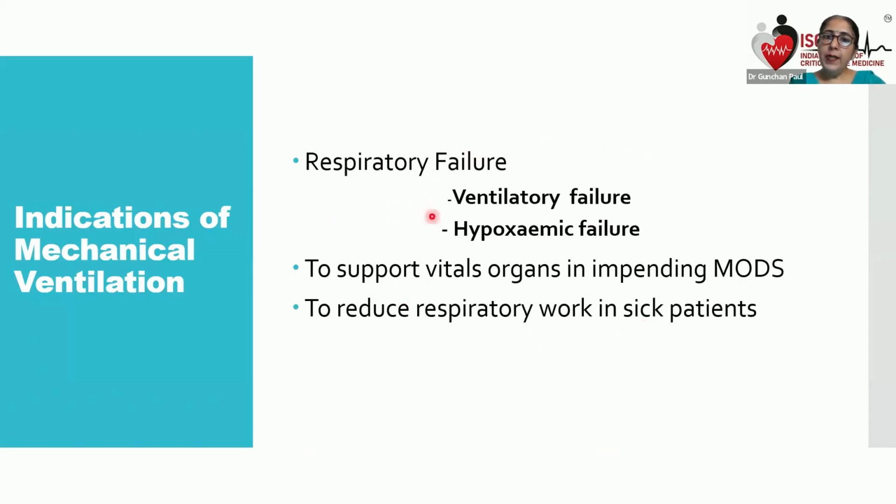When I'm talking of ventilatory failure, I mean to say that if this room is well ventilated, it means all the bad gases are moving out. So ventilatory failure, I'm talking of carbon dioxide. When the lung, as a machine, as a pump, is not moving, carbon dioxide is collecting, there is hypercarbia, so there is ventilatory failure. While on the other hand, if the lung parenchyma has a problem, we call it hypoxemic failure. So there are two types of respiratory failure. For both, we can use mechanical ventilation.